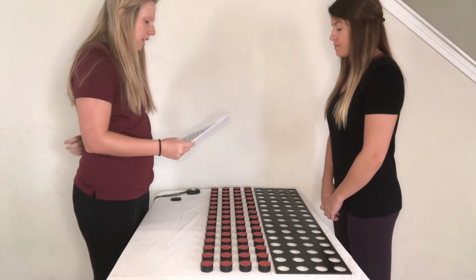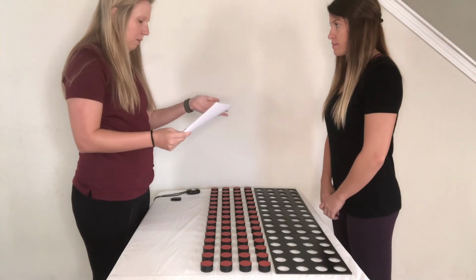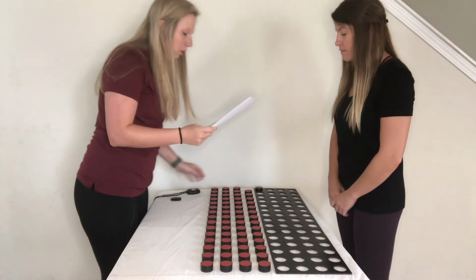The object of this test is to see how fast you can put the discs into the holes of the board using only one hand. You will want to use your dominant hand. You must begin on your right. You pick up the bottom disc and insert it into the top hole of the board.